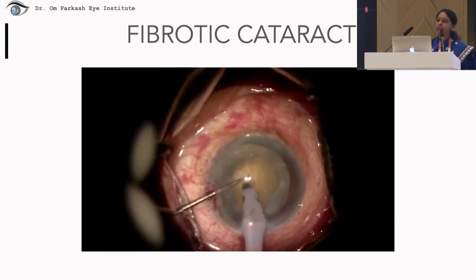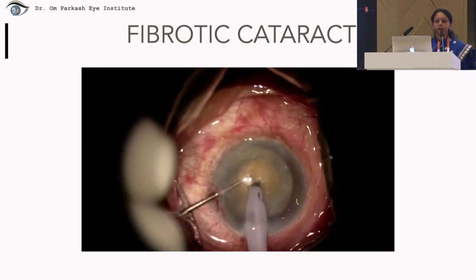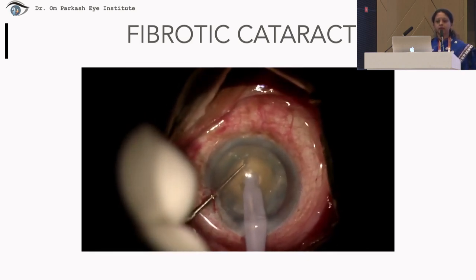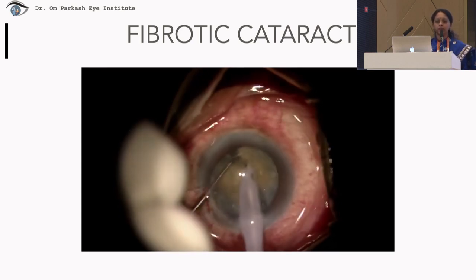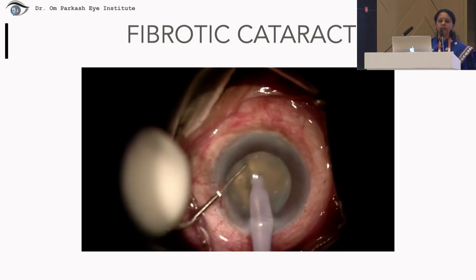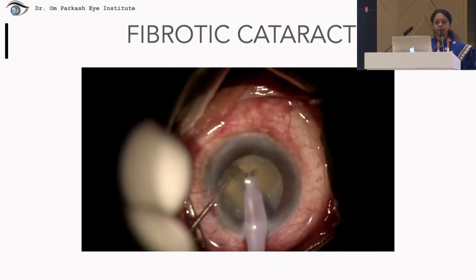Now the cataract is very dense, so a short and deep trench is made, and using a sharp chopper in a single go, the two heminuclei are separated, they are chopped. We can see that there is good lateral separation on one side. Now the nucleus is rotated and the remaining lateral separation of the heminuclei is made.